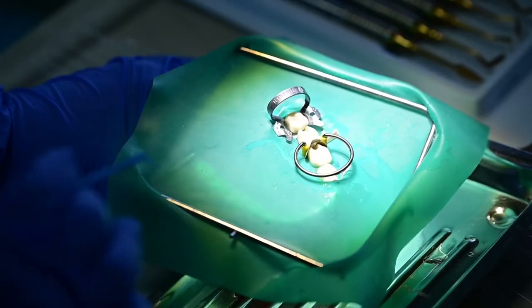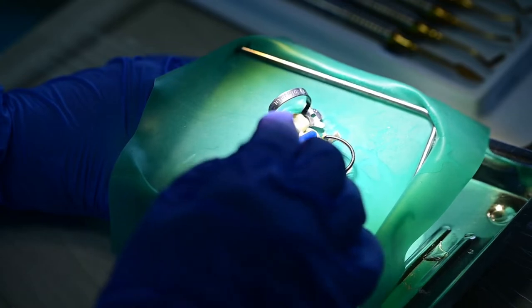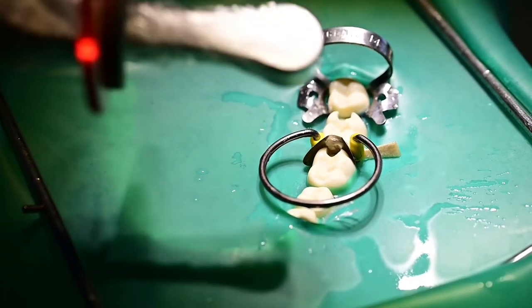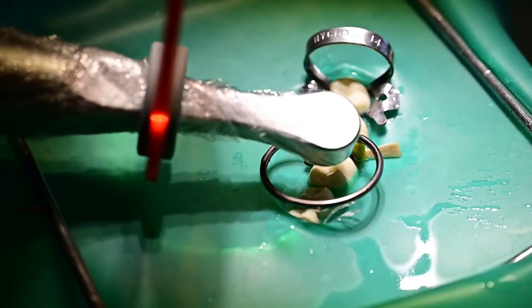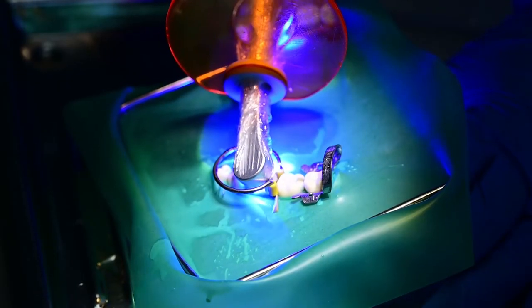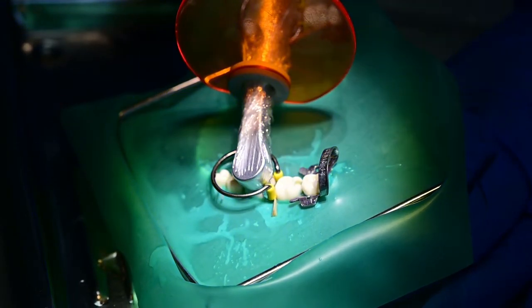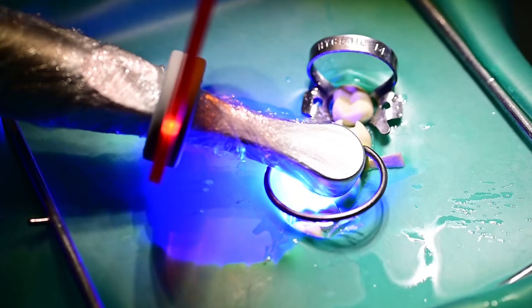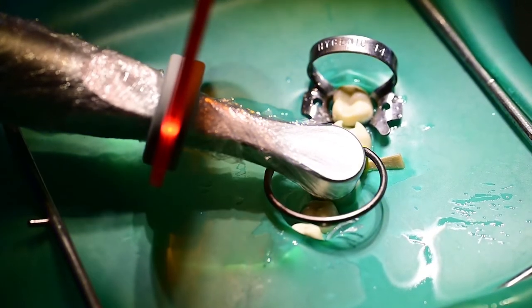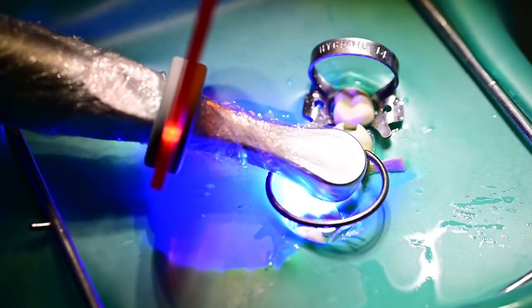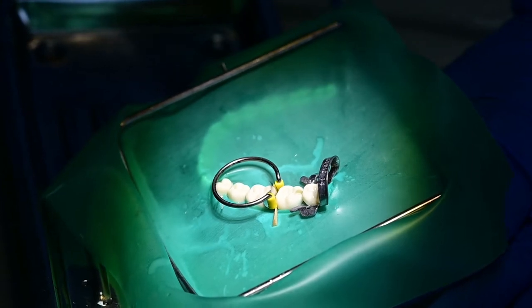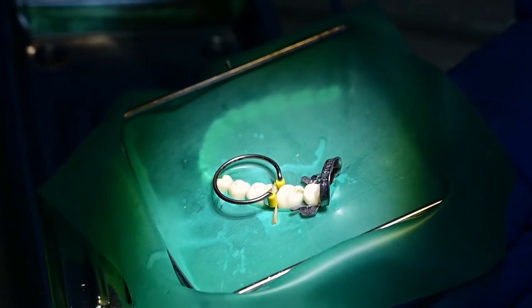So next we apply the bonding agent. I only need to do 20 seconds. Remember you have to be as close as possible, 90 degrees and close as possible so that you have enough irradiance onto the cavity. We are now ready to dispense the material into the cavity.